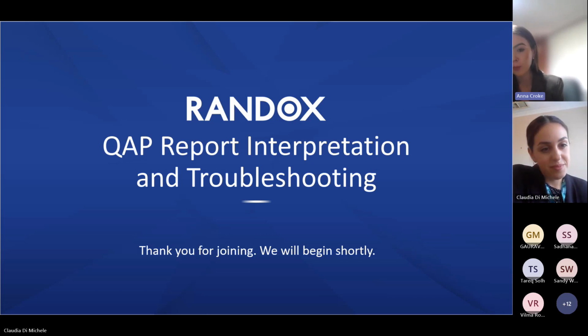So lots of you are probably joining us if you didn't attend our recent QC Roadshow. So no problem, we're going to cover off some of the core content in this series of webinars. So starting today with RIQAS report interpretation and troubleshooting.